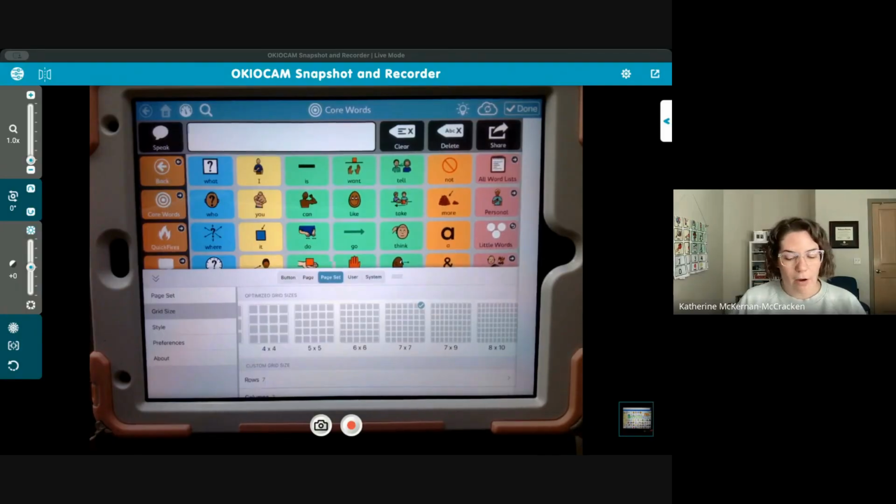And if you think about, for example, the keyboard on your cell phone, imagine that when you first learned to type on a cell phone, I gave you a really simplified, stripped down keyboard that only allowed you to say a couple of words. And then once you got really good and fast at it, I changed it on you. All of a sudden, you have way more words, but you have to start from scratch with your learning. And that's what we're doing to an AAC user if we change their grid set.